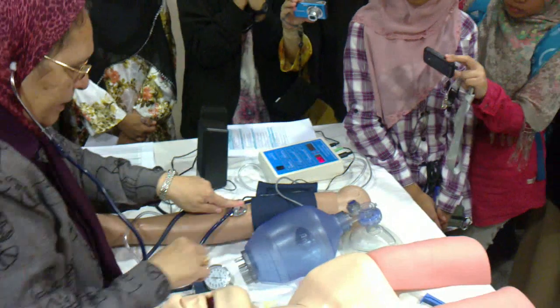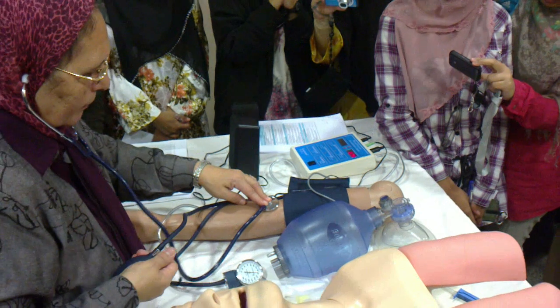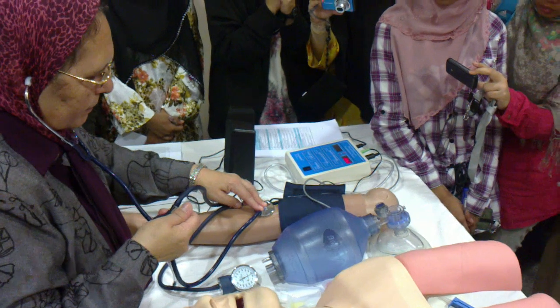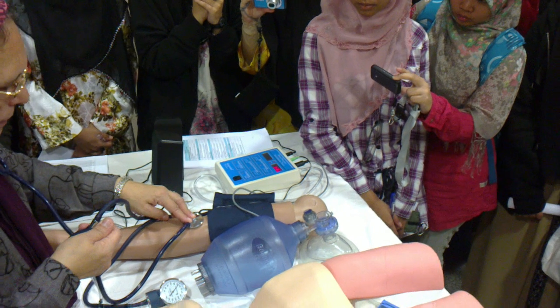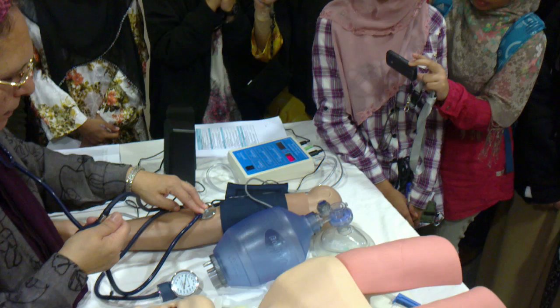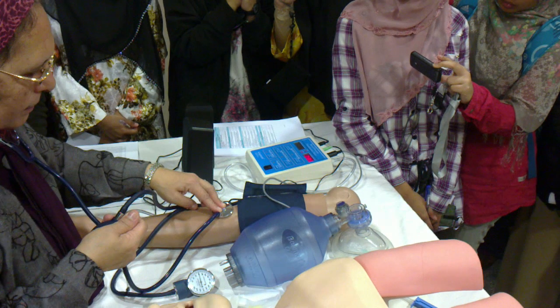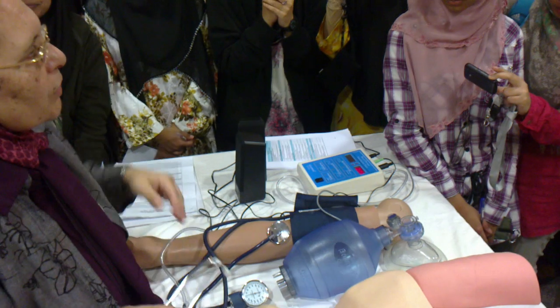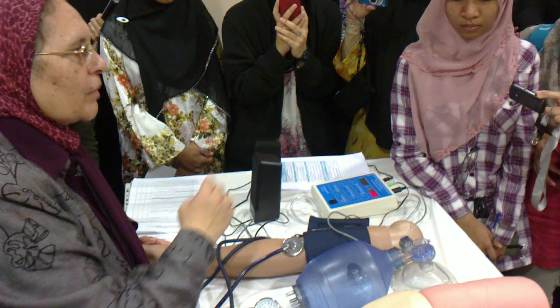Okay, like this, and then I will deflate. 140. 140/80. Systolic, 140/80. So at the end, thank you, your blood pressure is 140/80.